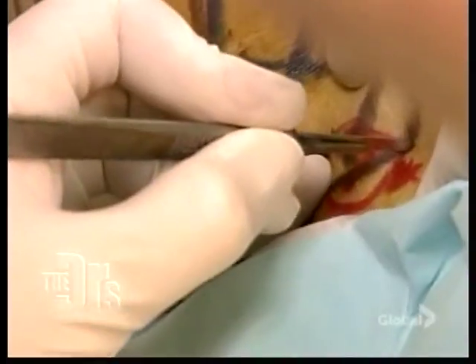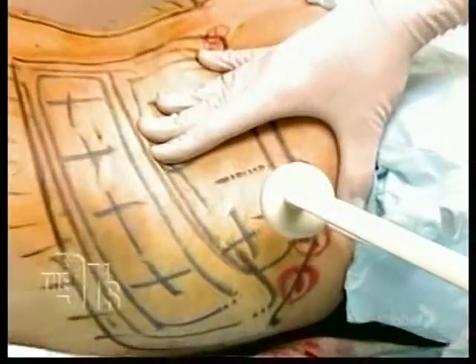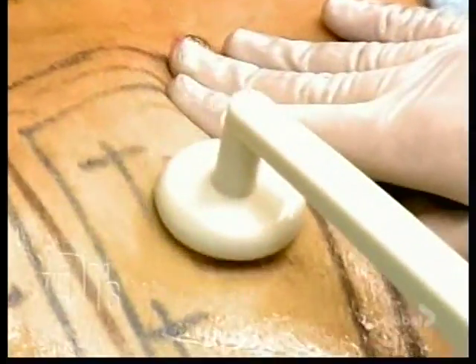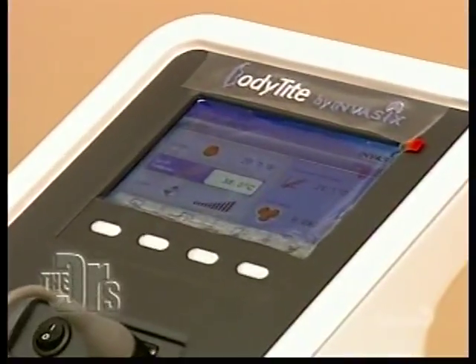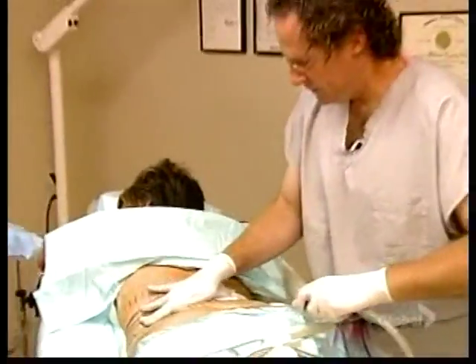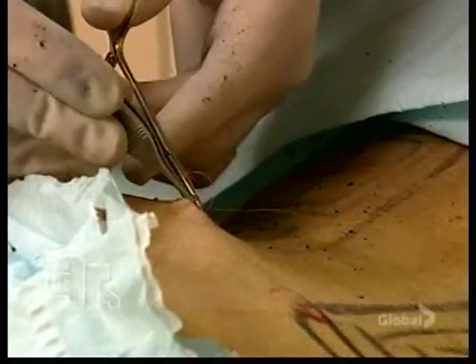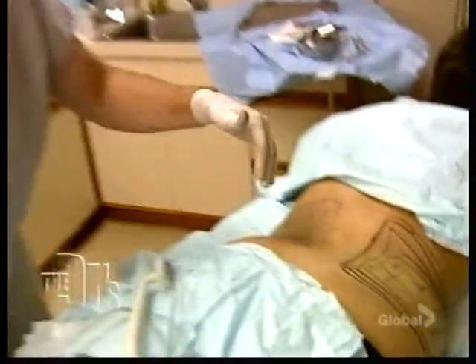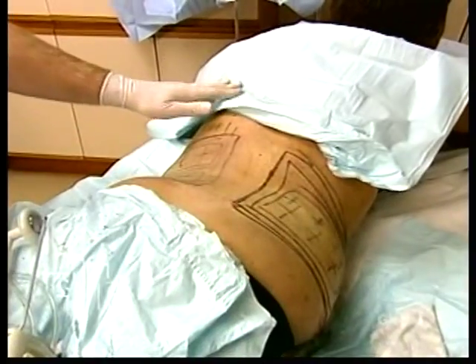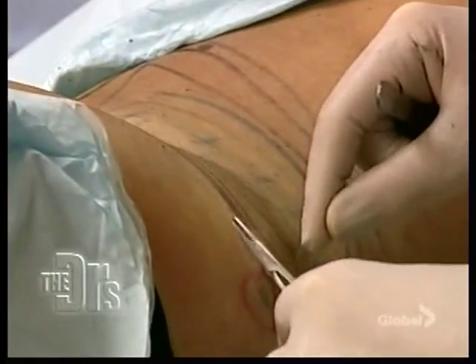Here we go, so that when these are going together under the skin, they're forming like a sandwich. We're really heating up the skin right now, and you can see some of the fat coming out. You feel pressure? A little uncomfortable, but it's fine. We're almost done, this side. I think there's an obvious difference between the side that wasn't done and the side that we just completed. There's not a lot of resistance at all. I'm gonna put a stitch in this.